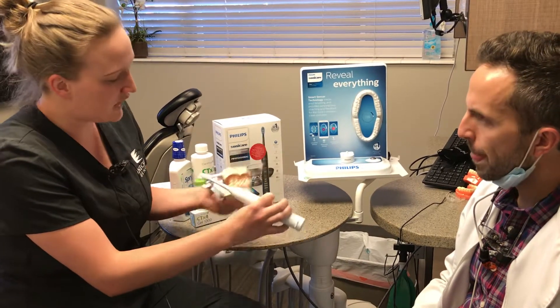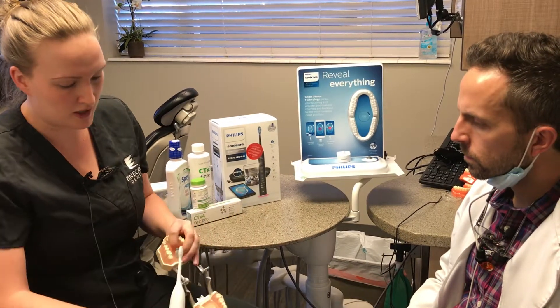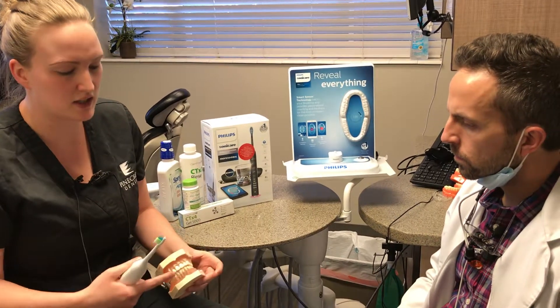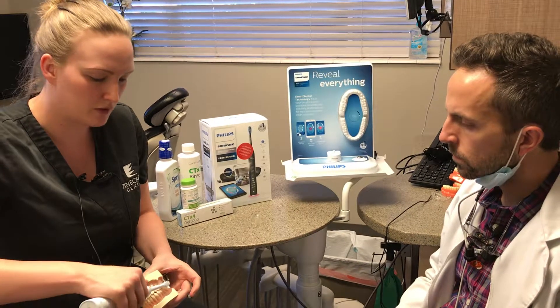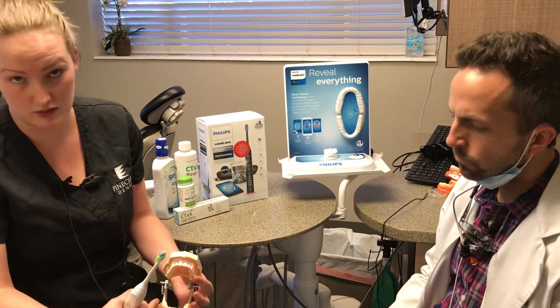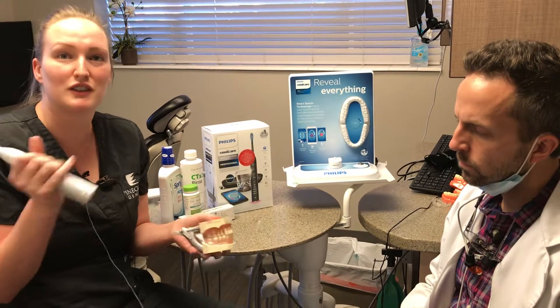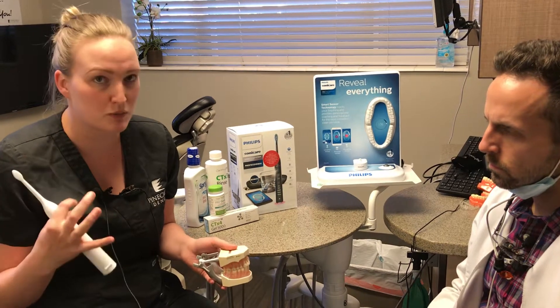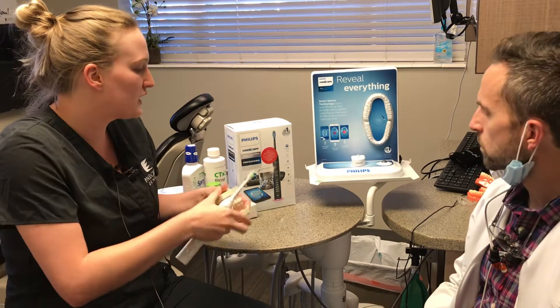The app follows along and has you do the outside by your cheek and then jump inside to do the inside on the roof of your mouth. Once 30 seconds have gone by, it moves you to the next area — the top left, then the bottom right, then the bottom left — so you cover your whole mouth. It also has a pressure sensor for those who are too aggressive or have sensitive areas, helping you keep cleaning gentle.